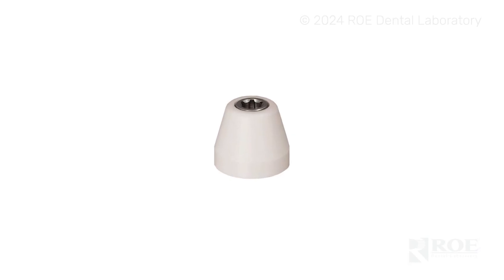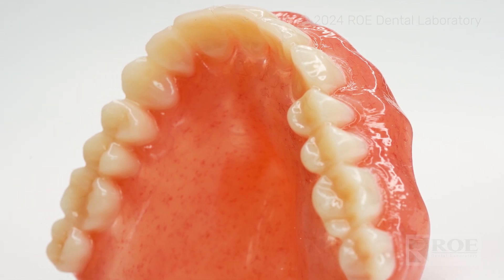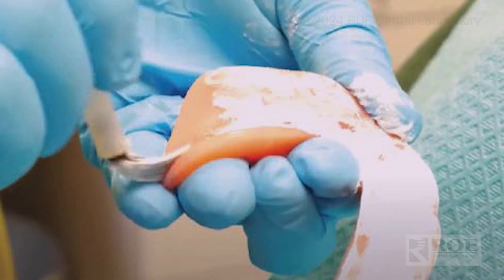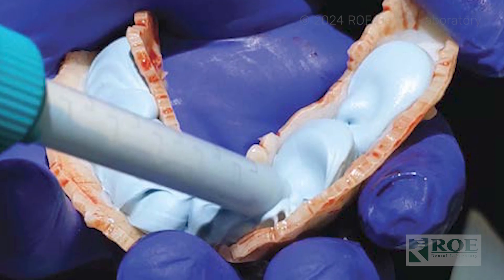After that, take the multi-unit abutment healing caps and seat each one of those on the multi-units. You may have to relieve the denture a little bit in the different positions where the implants are, because there's a healing cap on there now. Then do a reline impression of the healing caps in the mouth — express your material, medium body bite reg, your material of choice — and express that into the denture and go ahead and seat the denture in the patient's mouth.